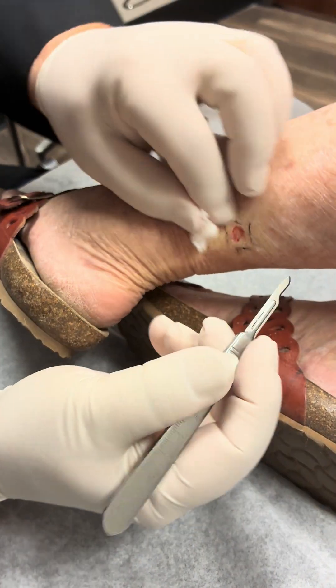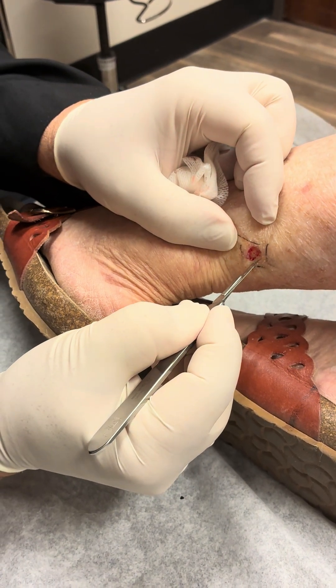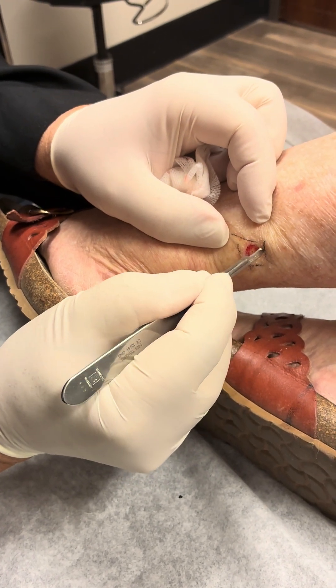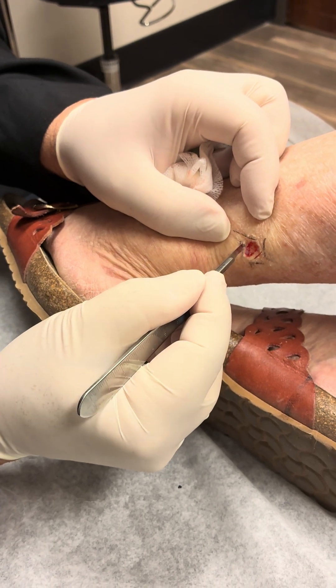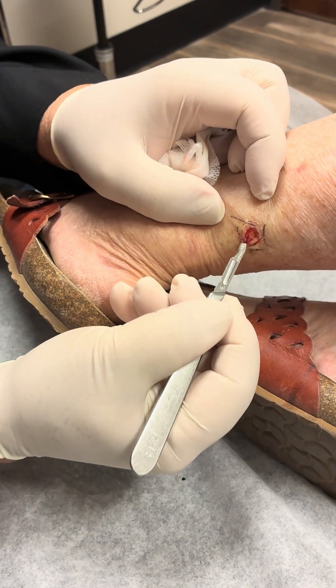This is quite pain-free today. We must be in a good mood. Then we're going to make a cut around it. Got to leave a little margin here of safety.